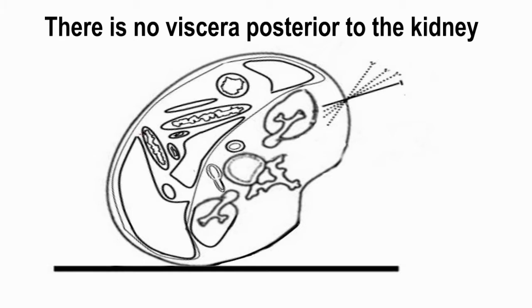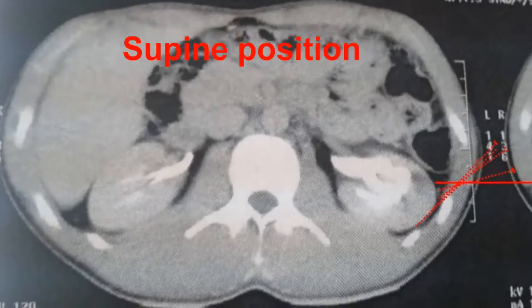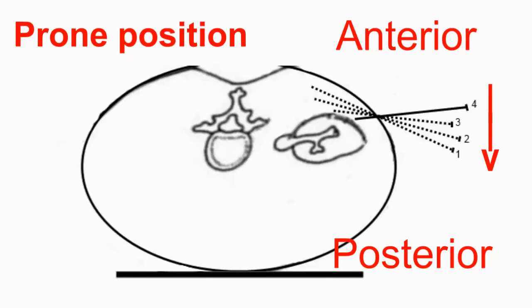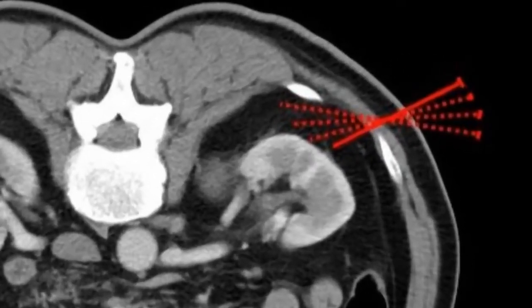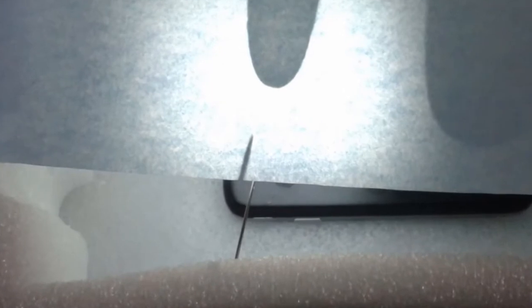There is no risk of visceral injury posterior to the kidney. The same technique can be used in the supine position. In the prone position, the movements of the needle are inversed from up to down. Lateral view in a glove model — the tip of the finger is used as the calyx.